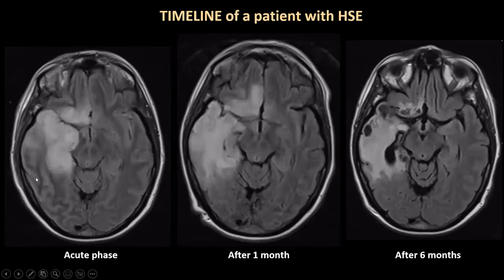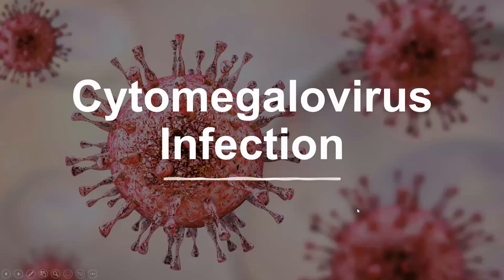Contrary to what we see in herpes simplex encephalitis: in the acute phase we see clearly asymmetrical cortical temporal edema with also involvement of extra-temporal structures and neocortex. A month later these abnormalities are still present and have not subsided. Another six months later, there are areas of tissue destruction — what is now hyperintense on FLAIR is no doubt gliosis, so scar tissue and no longer edema. There is also a clear enlargement of the temporal horn of the right lateral ventricle, suggesting tissue loss.